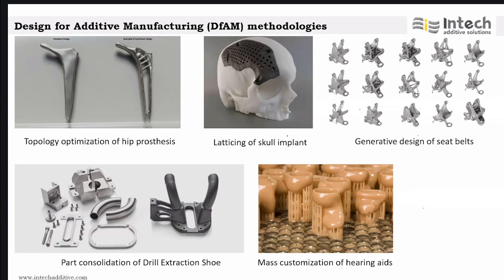So you can take different values of K, analyze the accuracy or any other performance metric, and based on that, choose the best of the values. This cranial implant has been printed by trial and error and has been placed on that basis. Is it clear?